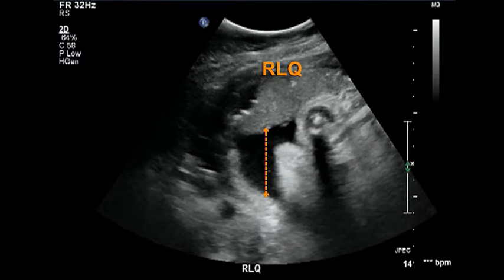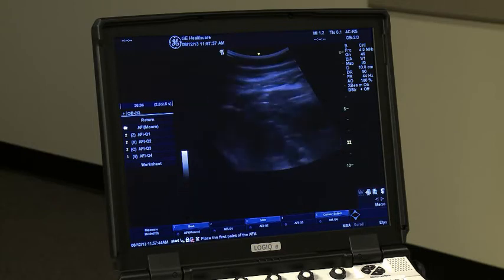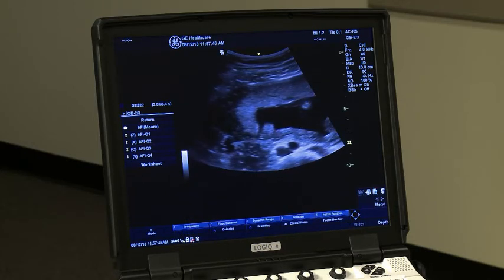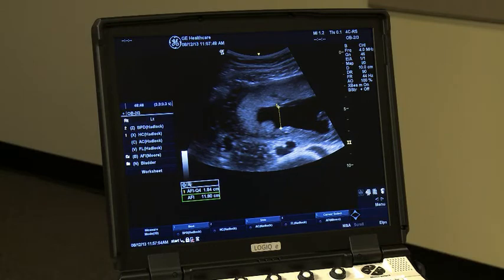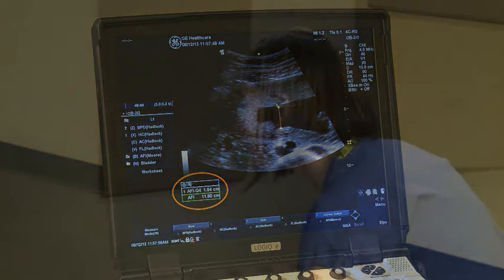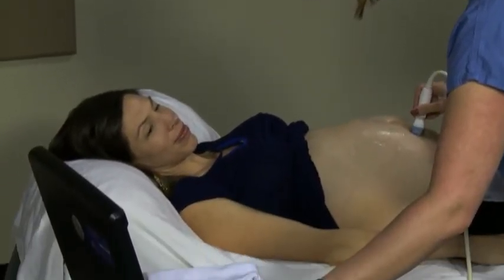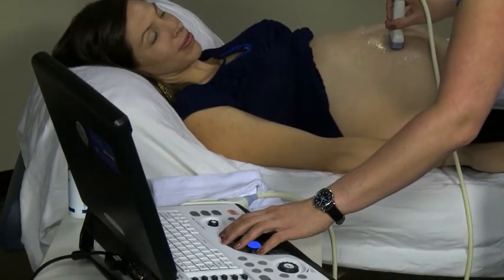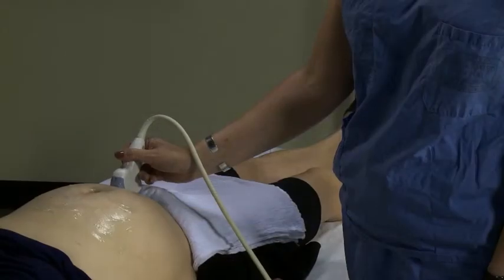It is important to always measure each quadrant in the same way. If you do not, then you will not get an accurate AFI. After you have measured each quadrant and saved each image on the ultrasound machine, you will see an AFI value automatically calculated. An AFI less than 8 centimeters can indicate problems. In this case, the AFI value is 11.8 centimeters, which is normal.